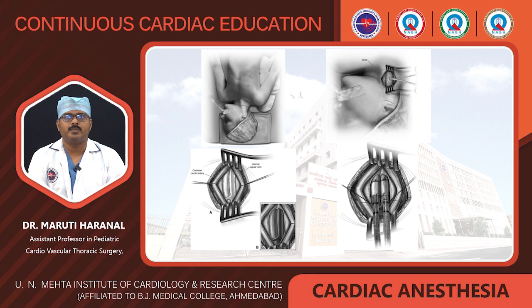sternocleidomastoid. It is either split or medially retracted to get access to the carotid vessels, and following heparinization, the carotid artery and internal jugular vein are cannulated.